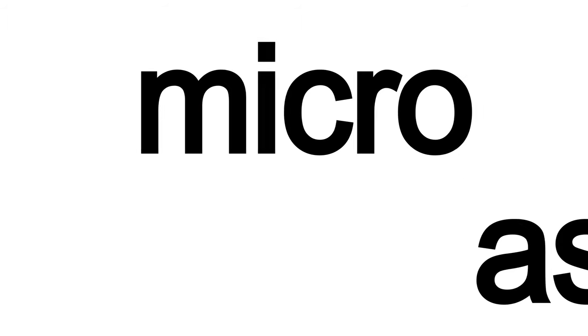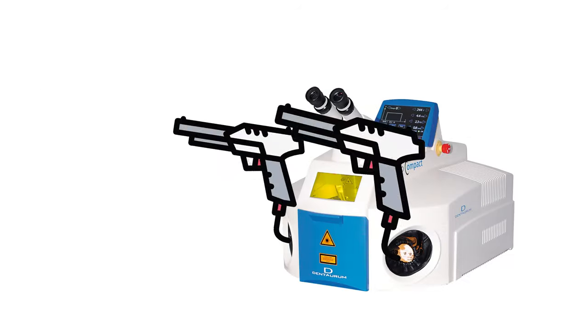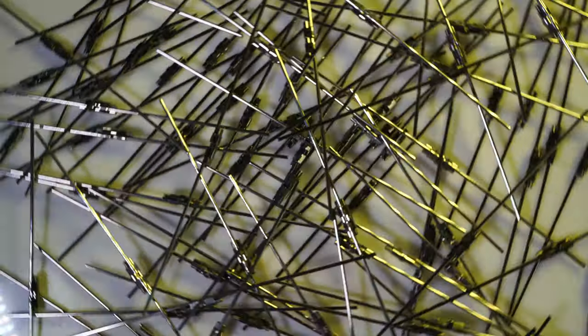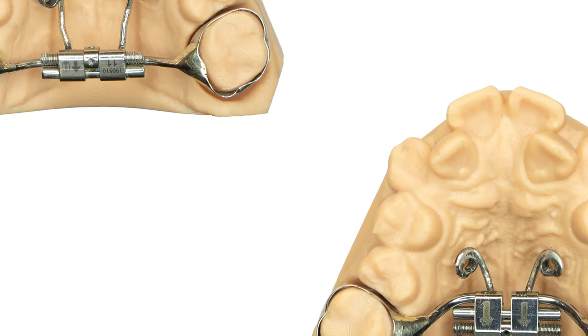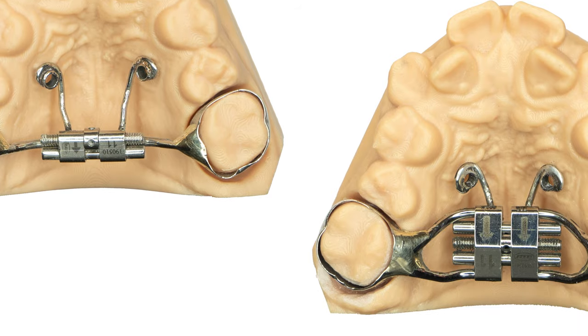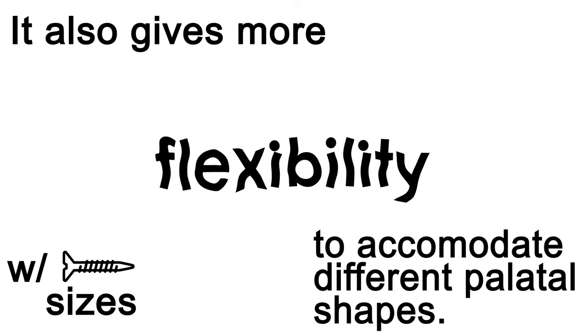The next appliance is the Marpey, Micro Assisted Rapid Palatal Expander. A conventional RPE screw is used and TAD housing rings are laser welded to the screw housing based on the locations indicated by the clinician. Any brand and most styles of screws can be used. The TAD locations need to be clearly indicated on the cast. A laboratory analog may also be used to indicate TAD locations. The Marpey design gives more flexibility for TAD placement locations within the palate, and also more flexibility with screw sizes to accommodate different palatal shapes.